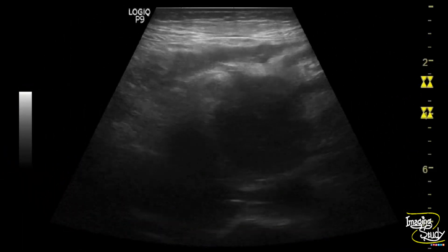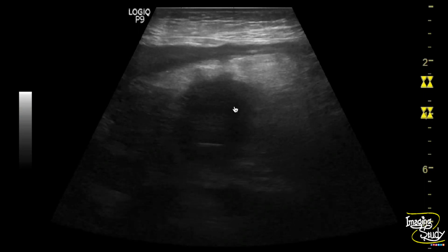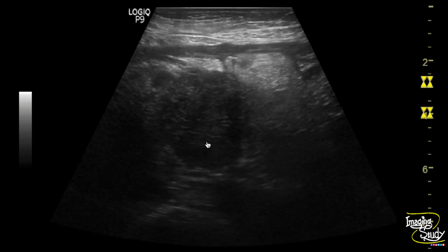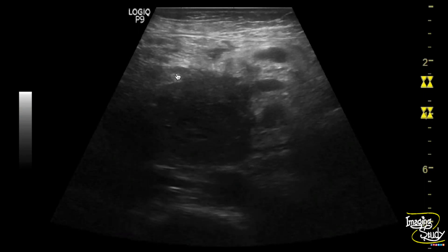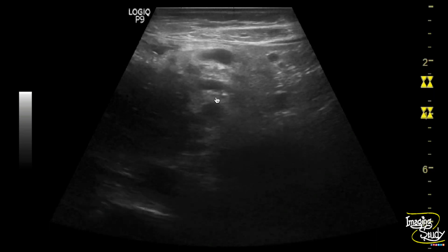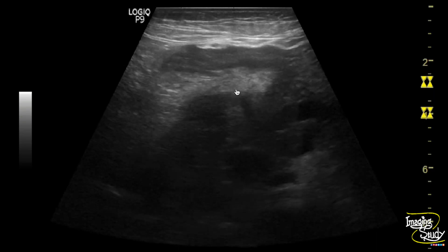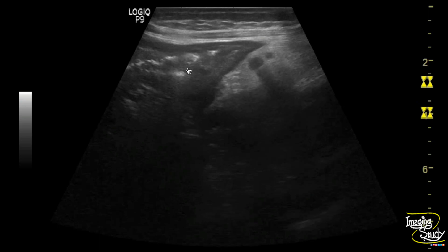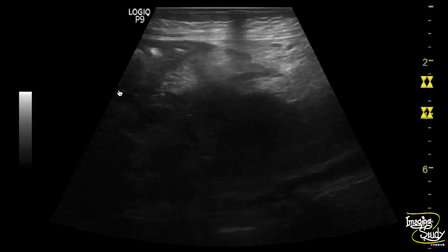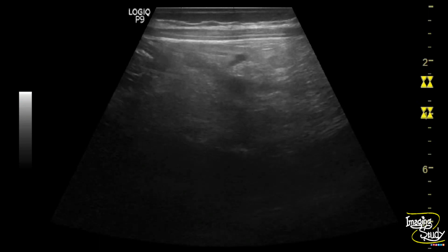Now let's look at this lesion with the high-frequency linear transducer. You can see the mass lesion here — the margins are ill-defined and irregular. The main pancreatic duct is dilated. The adjacent pyloric wall of the stomach is also thickened, possibly due to congestive gastropathy.